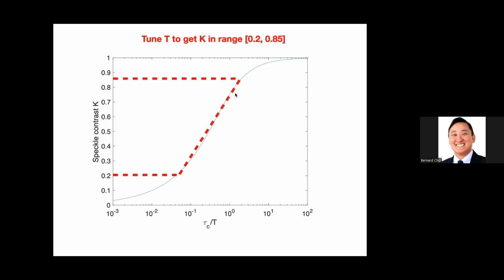I think I know what you're saying, but once you get a speckle there that has an intensity, how is that speckle changing over time? That's what we're looking at, how that intensity changes over time, not the actual sinusoidal wave.